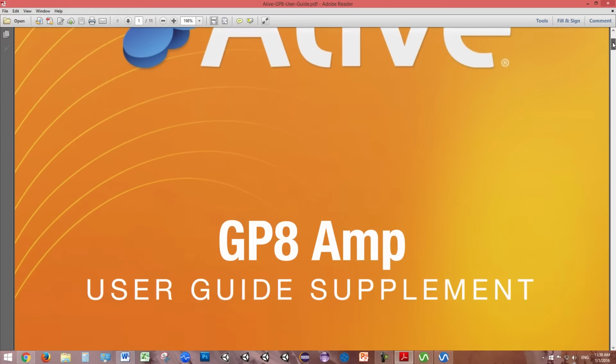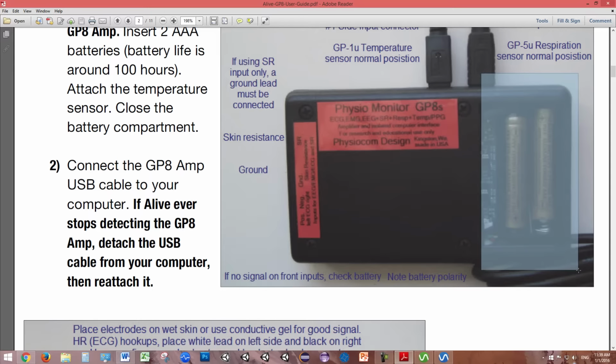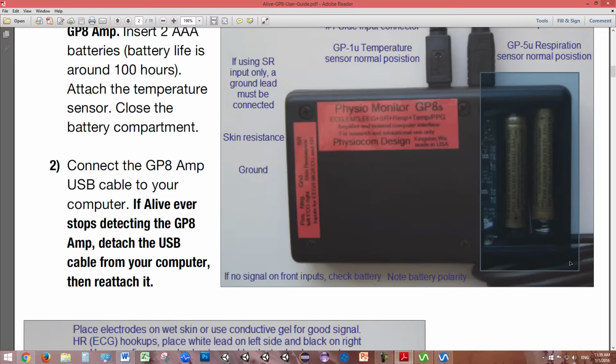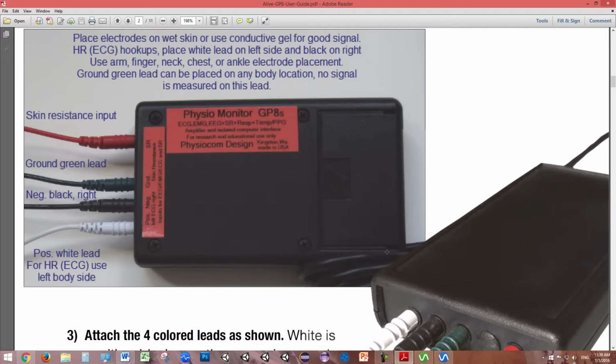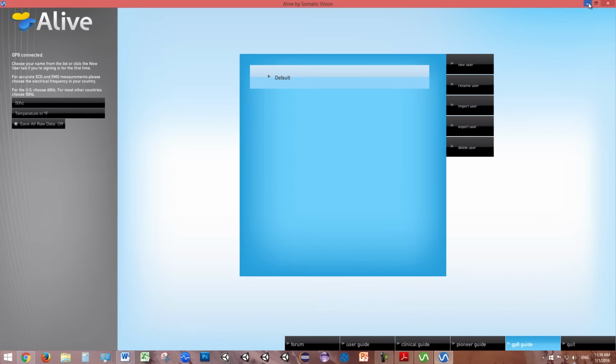If your GP8 amp has a place to put batteries, insert two AAA batteries into your GP8 amp, then connect the red, green, black, and white leads, as shown. Connect the GP8 amp to a USB port on your computer, then open Alive. If it's your first time connecting the GP8 amp to your computer, wait for a minute for it to automatically install the GP8 amp drivers before opening Alive.